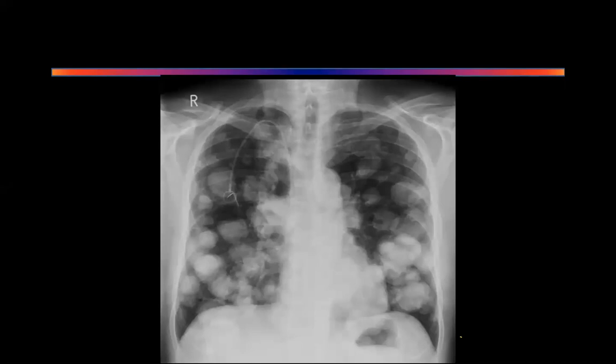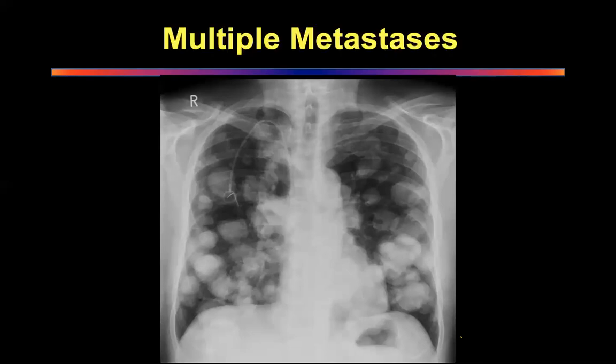Very good. Differential diagnosis, it looks like cannonballs. Cannonball metastases, likely cancers which can cause this? Likely cancers. What are the different cancers? Adenocarcinomas. Ovarian cancers, sir. Follicular carcinoma of thyroid, sir. More common are breast cancers. Breast cancer. I want you to talk about breast cancers. Okay. All right. Fantastic.